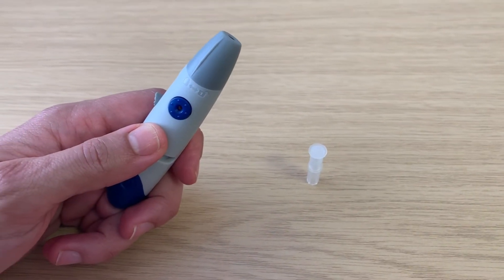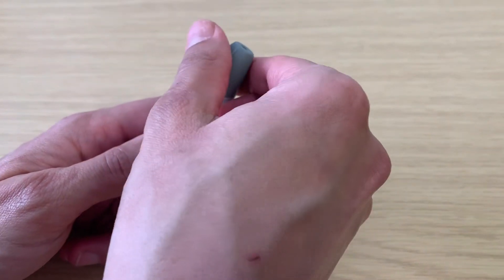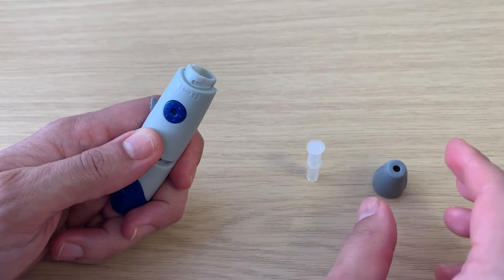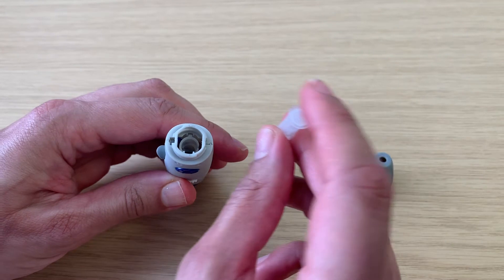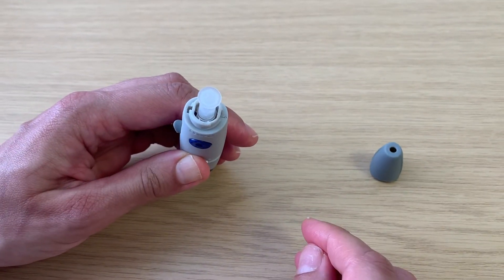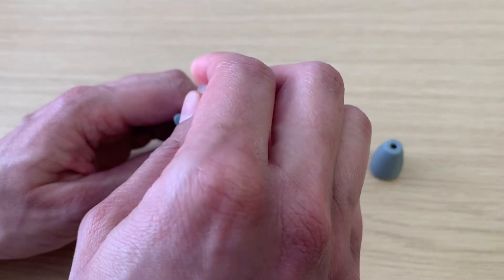Hold the lancing device firmly in one hand, ideally in the middle, then twist the grey cap to the right to remove it. Take the needle, ensuring that the round disc part is upwards, and place it into the hole on the lancing device. Holding firmly onto the lancing device, twist the needle cover cap to the right to remove it.